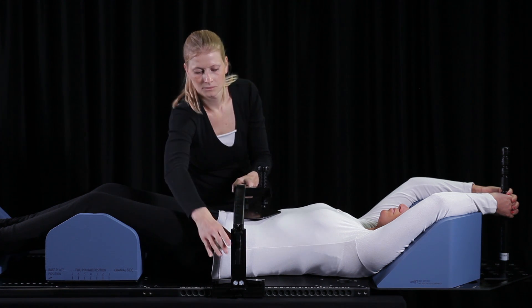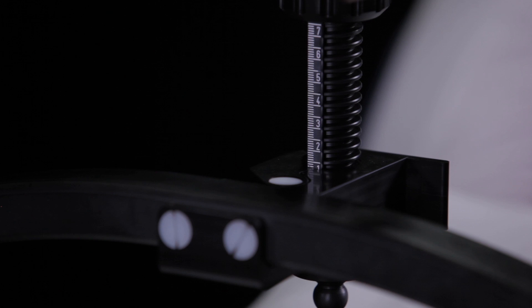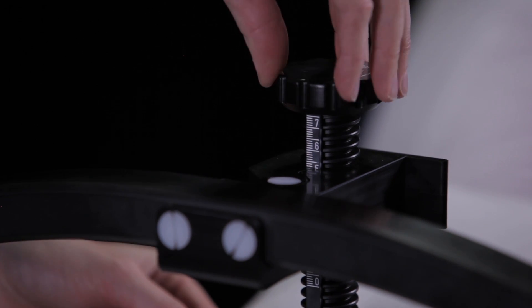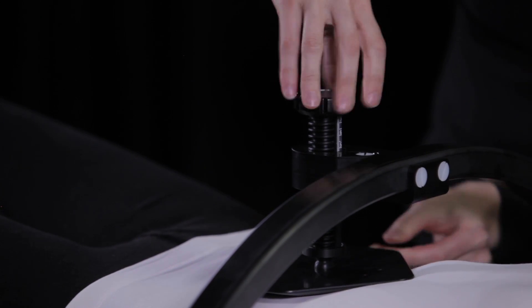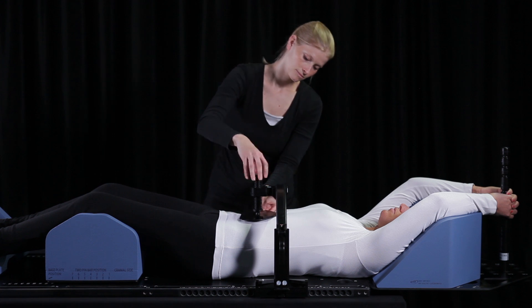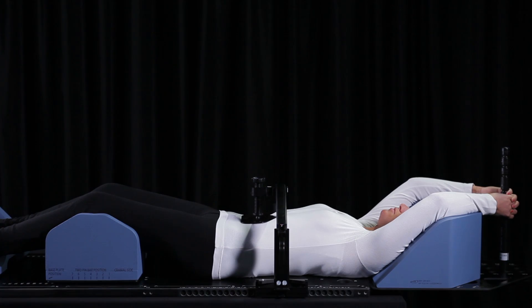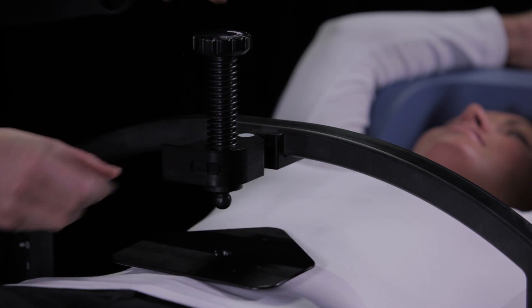Once you have reached the correct position, close the locks again. The different heights are numbered from 1 to 5. Fasten the screw until you have reached the desired pressure or height on the abdomen. The arch can be positioned with the screw facing the cranial end of the baseplate or facing the caudal end. Choose the correct position so the arch is located outside of the treatment field. In case of an emergency, the screw can be released easily by opening the locking system and pulling the screw upwards.